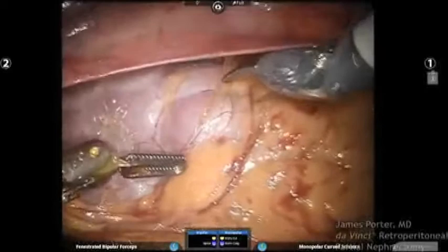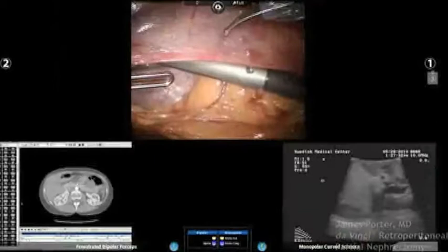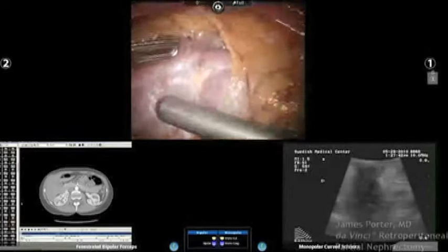But again, you need a very good assistant. You need somebody that knows how to use the ultrasound, and we're going to go to TilePro. Steve, can I get the wireless mic? I mean, the wireless. Okay, so what we have, I don't know if you guys can see the TilePro image. Yeah, we see it. Okay, so Nance, let's go back and forth.